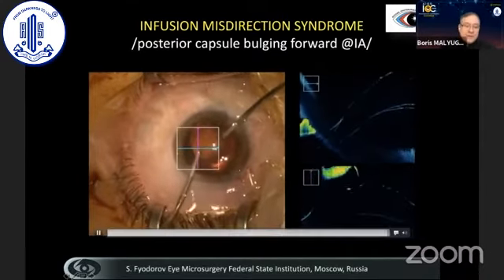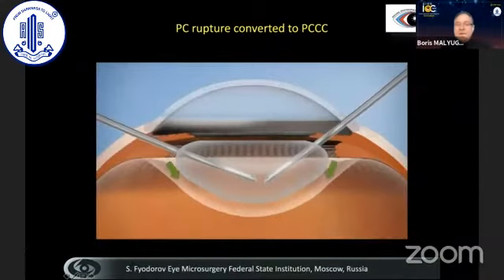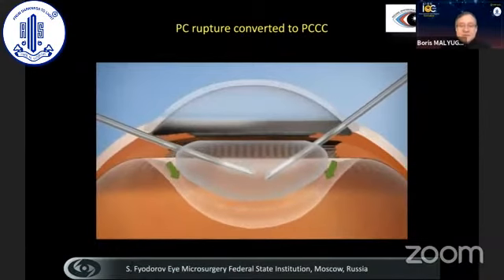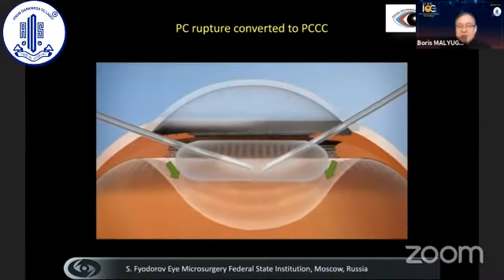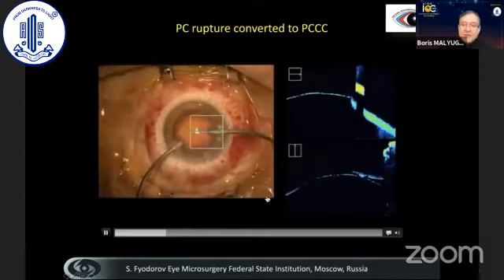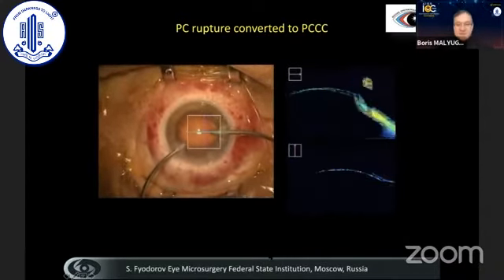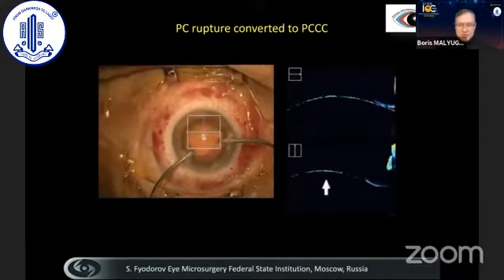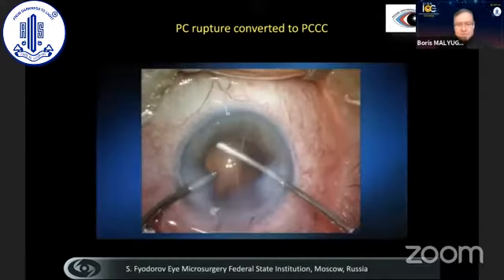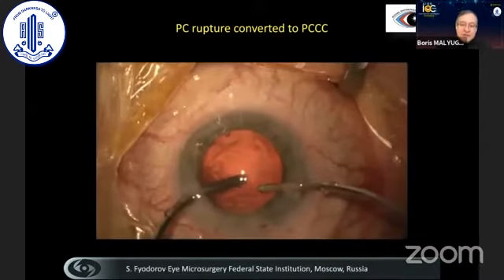Here is the mechanism of posterior capsule rupture: during irrigation aspiration utilizing bimanual handpieces, the capsule is aspirated and obviously damaged. This is the case during the irrigation aspiration phase of the procedure. Usually it happens when you try to polish the capsule, and the radial folds nicely show what happens during that phase of the procedure.